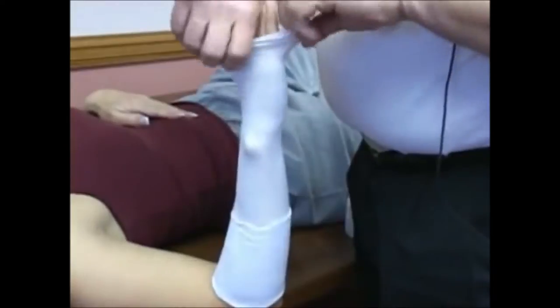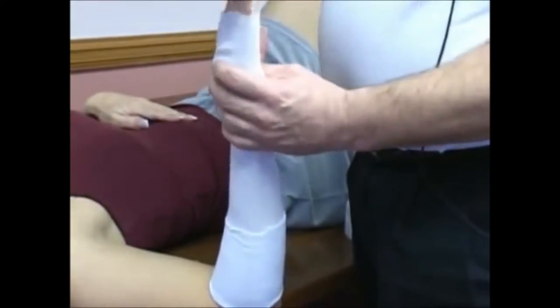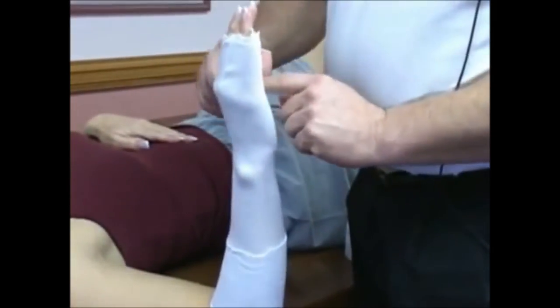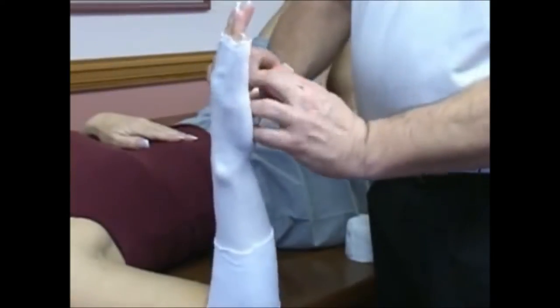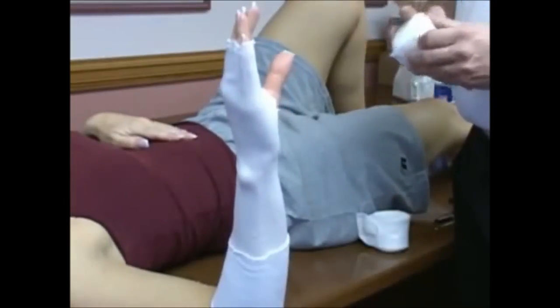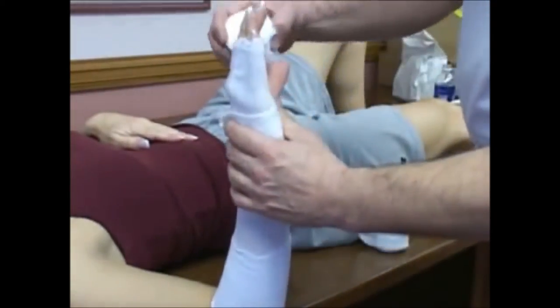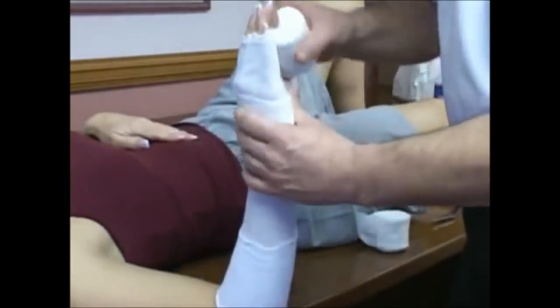You can even cut more if you want up here and fold it back to create a lip to fold underneath. I always kind of pull the stockinette out just a little bit and create a little passage through here. Taking the synthetic padding, I'll bring it right around through here, through the web space, leaving the stockinette out a little bit so I can fold it back.